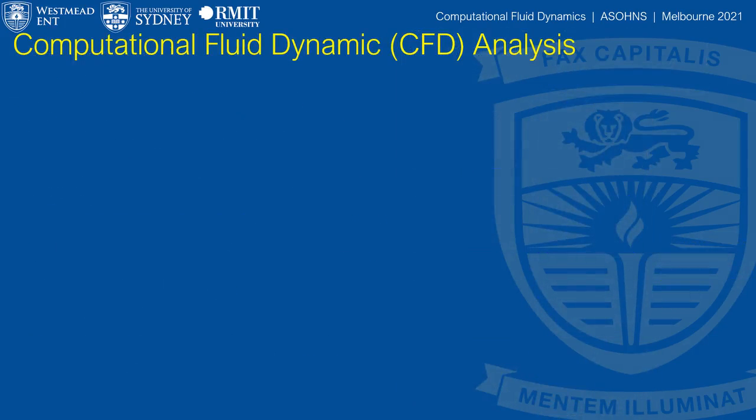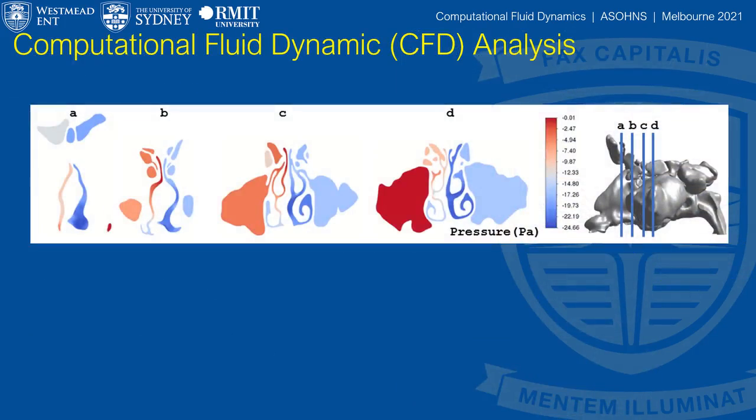Following geometry construction and modification using the 3D Slicer and Meshmixer software, the fluid flow can be simulated in ANSYS Fluent. The current simulation was performed under steady-state conditions to represent an instantaneous inspiration event. To gain further understanding of the fluid flow and turbulence phenomena in respect to time, the simulation can be reiterated under transient conditions. However, this will require a significant increase in computational resource and therefore would not be suitable for point-of-care applications.